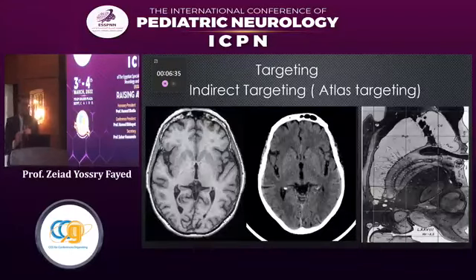What I'm going to do over the next few slides is to walk you through the steps which we do in order to perform the surgery. The first step happens even before the patient is admitted into the hospital, which is the targeting. We have many methods of targeting.